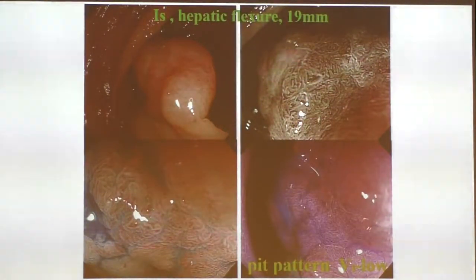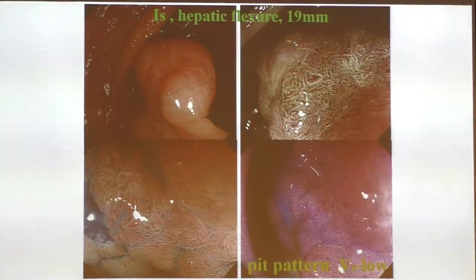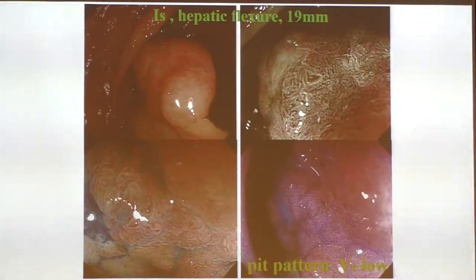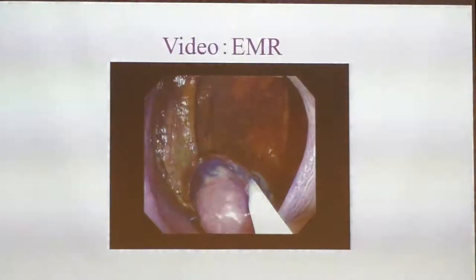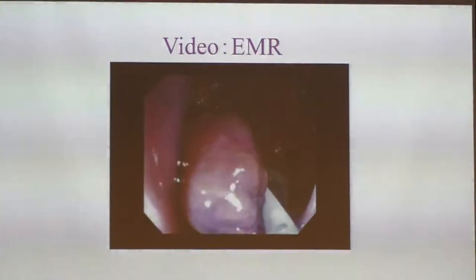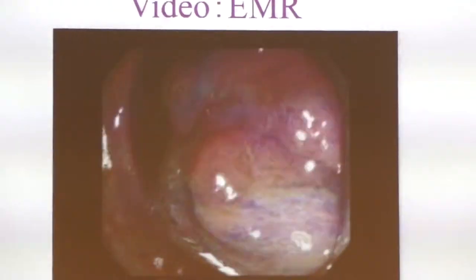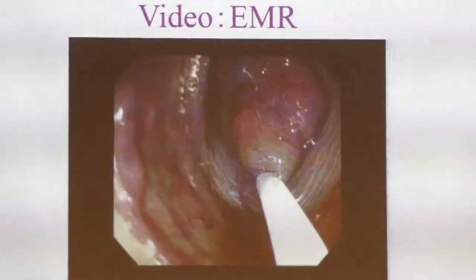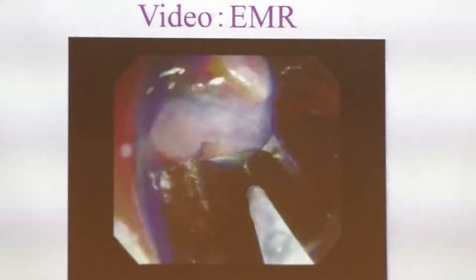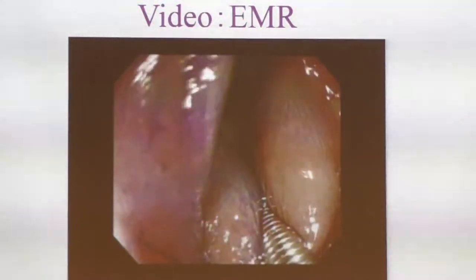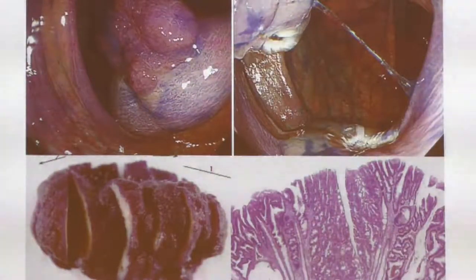Another case: the lesion was not very big, but it was located just on the hepatic flexure. In that case, you should start the injection at the proximal side of the lesion — the ascending colon side. Don't inject at the distal part first. If you inject the distal part, the injection will push the lesion toward the ascending colon, and you will not see the lesion quite well. After a good elevation, the resection was rather easy. The final diagnosis was also intramucosal cancer.